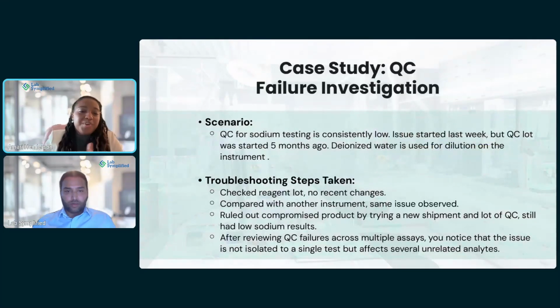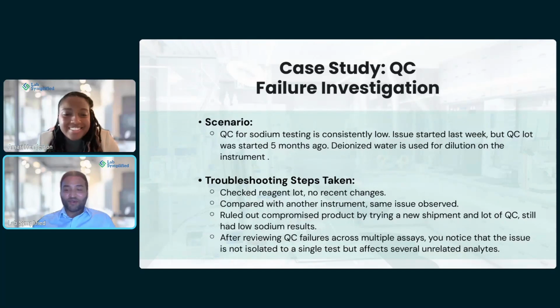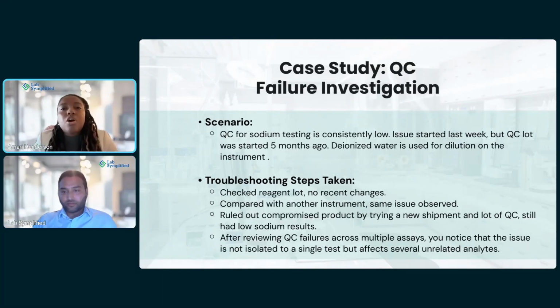We have a question from Joanna Santos. She asks, "What can cause a tight range?" A tight, narrow range. What I find is normally if you have a narrow range, your results are pretty precise. Your assay is pretty precise.